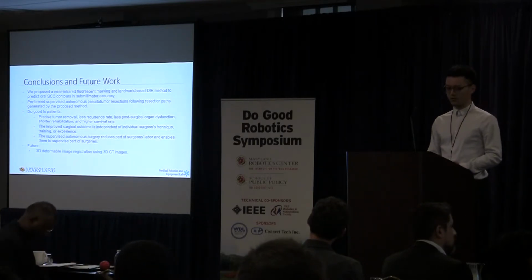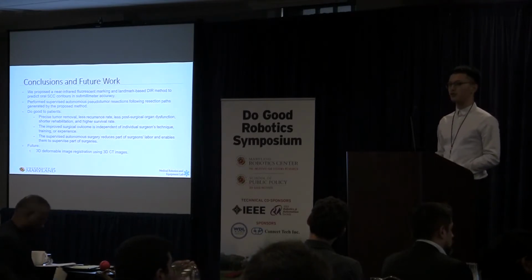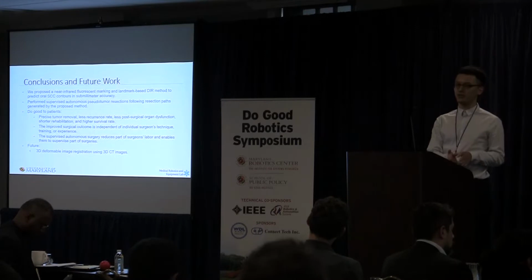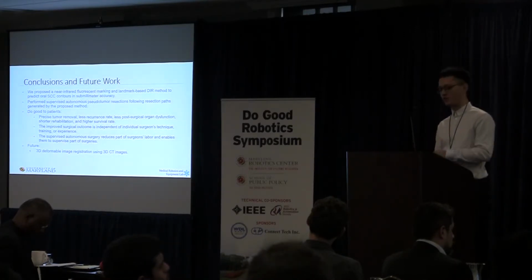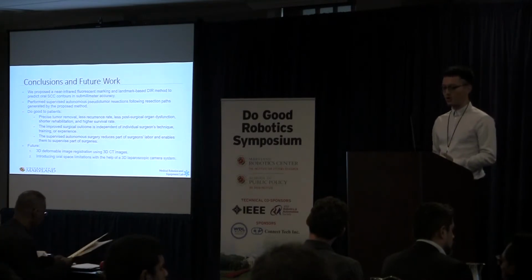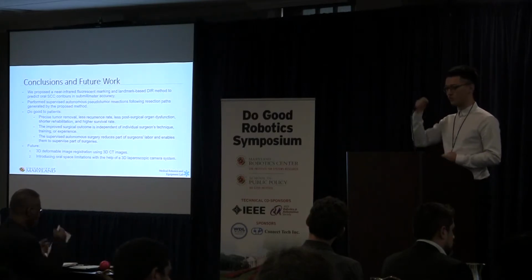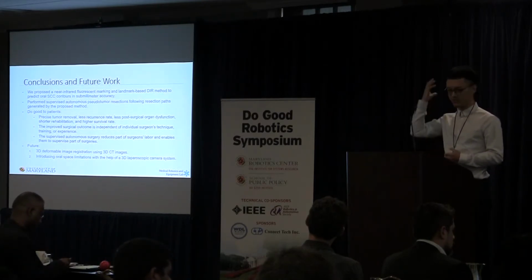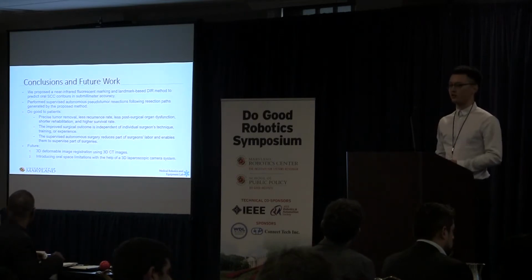For future work, first, we will do 3D deformable image registration, where we register the tumor bed in 3D, overlay it, map it back to 3D and control the robot. Second, we will introduce oral space limitations rather than just asking the robot to cut from the top, which should be the cranial or the jaw side, depending on the patient's location.